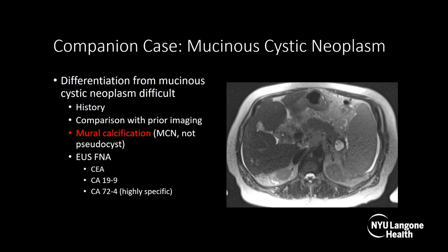Here's a companion case — a mucinous cystic neoplasm. Differentiating a pseudocyst from a mucinous cystic neoplasm can be difficult. You definitely need history: a history of recurrent pancreatitis leads you one way, and a fluid collection that arose during an episode of acute pancreatitis points toward a pseudocyst. Mural calcification is a finding you'll see in a mucinous cystic neoplasm but not a pseudocyst. FNA can also help, with amylase seen in a pseudocyst and CEA, CA-19-9, and CA-72-4 seen in a mucinous cystic neoplasm.